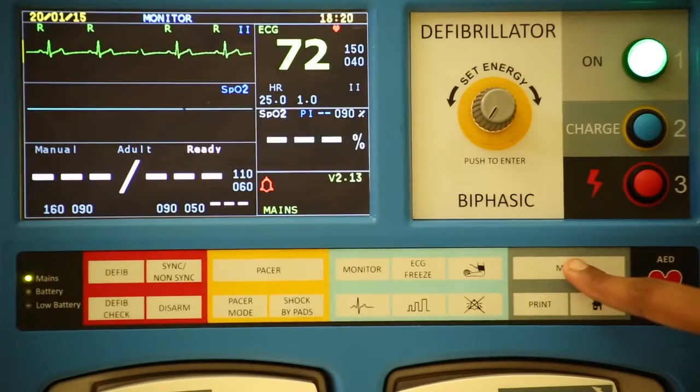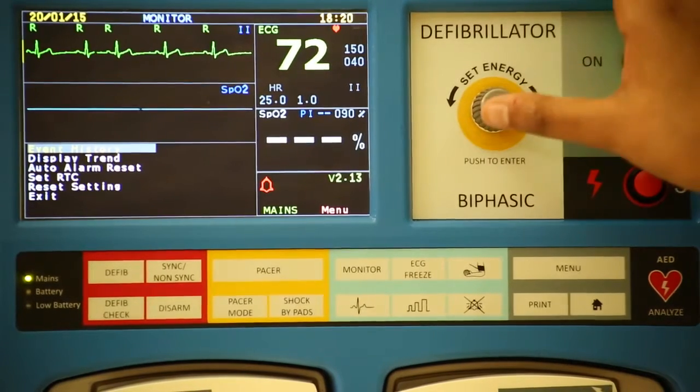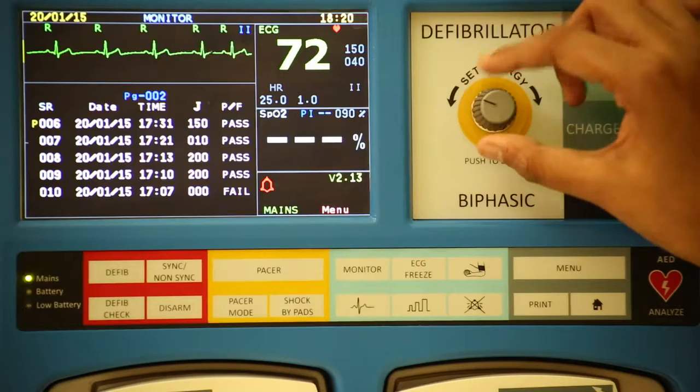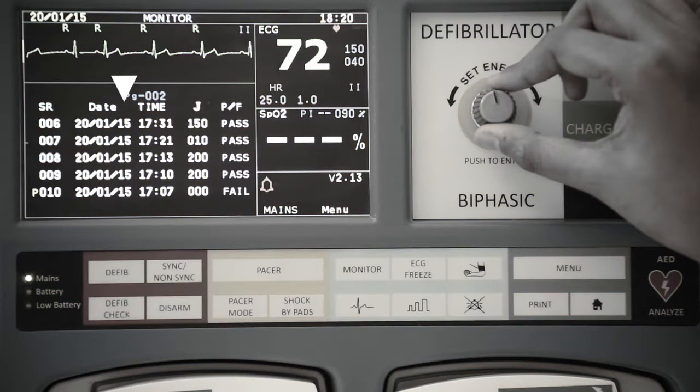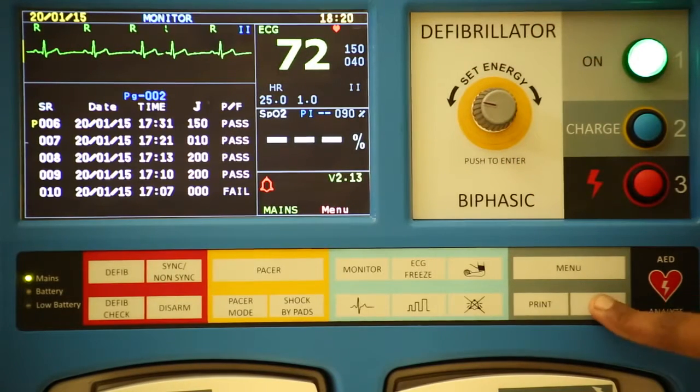The menu button opens a menu on the screen. It has options such as event history, display trend, auto alarm reset, set RTC, reset setting and exit. You can maneuver through these options using the encoder. The details of completed shocks will be seen in Event History option, and it contains serial number, date and time, energy in joules and status pass or fail. The last shock details will be replaced with latest shock details in the memory.